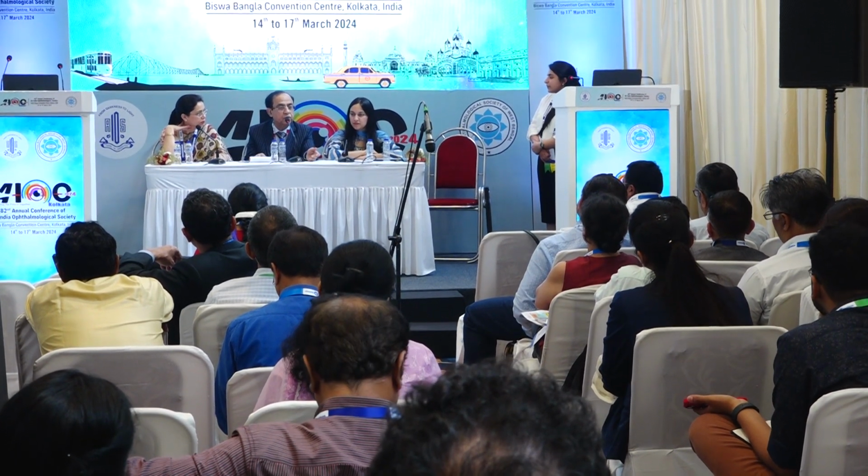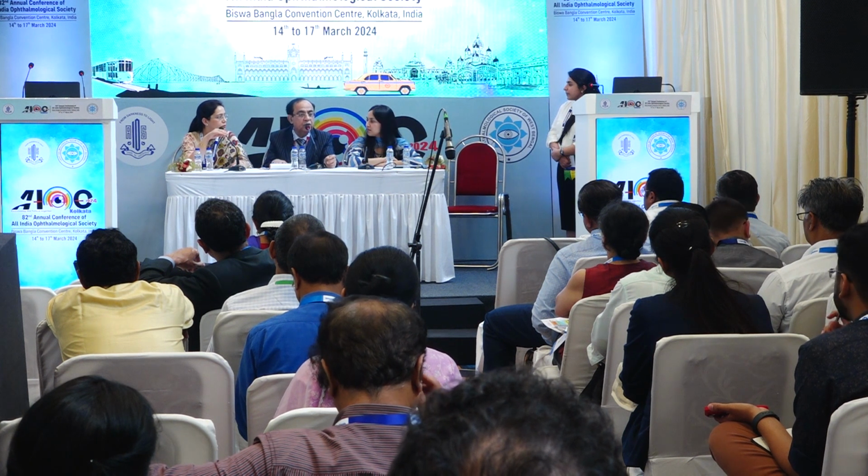Suppose, depending upon the machine, you are using 40% for the trenching, you can use 30% for chopping, maybe 25% for Phaco aspiration. So as you keep on going up, the power can be reduced, and the pulse mode is needed when you are doing the chopping and aspiration. But trenching you can do in a continuous mode.